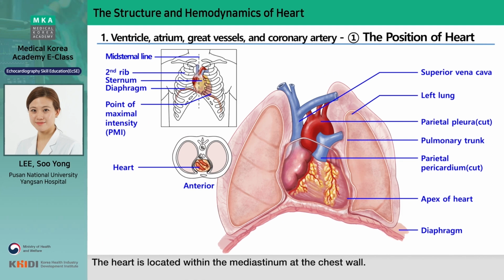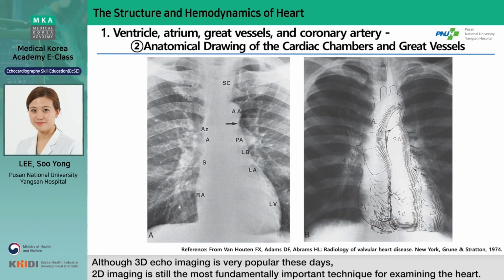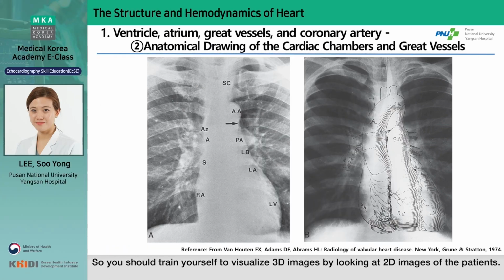The heart is located within the mediastinum at the chest wall. The cardiac silhouette can be examined by X-ray. So you should train yourself to visualize 3D images by looking at 2D images of the patients.